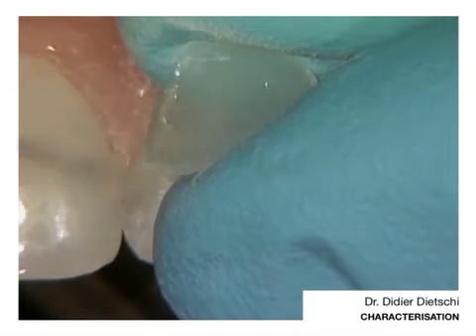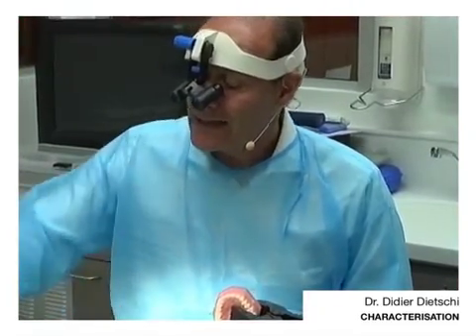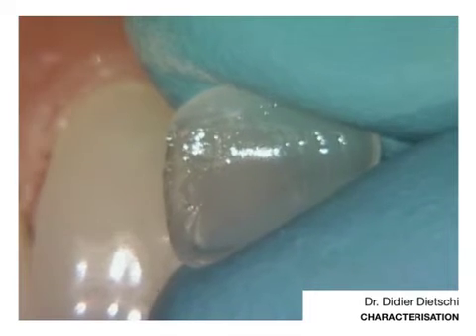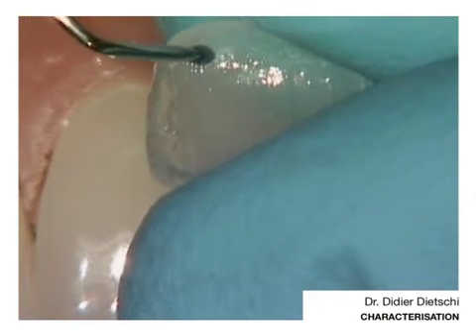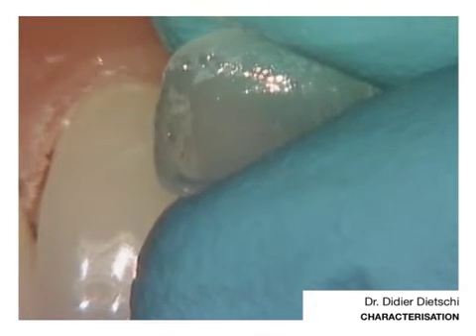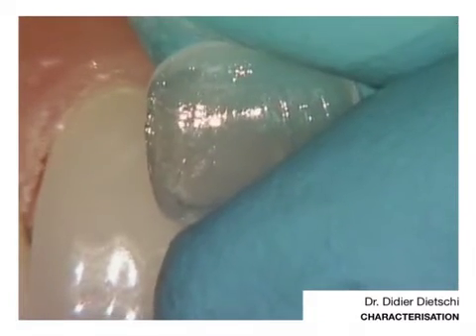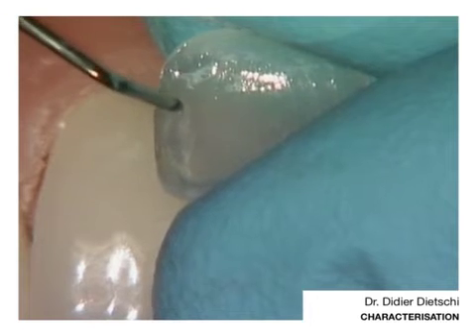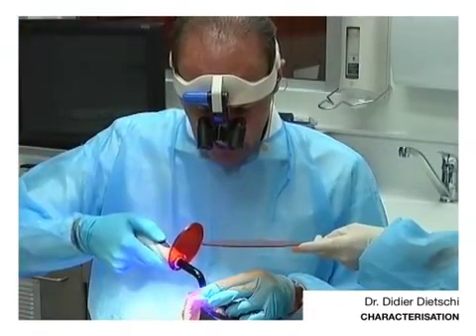Now I need to apply the color. I'm using here a more intense color. But you need to use very, very tiny amounts. You can use the micro brush to take away some excess if you are not happy. I will quickly light cure and just fix the shade in that spot.